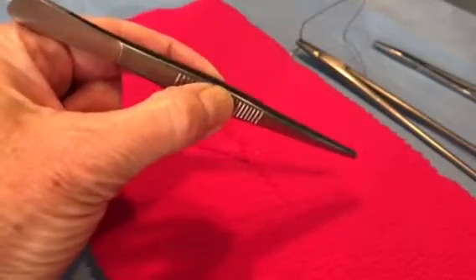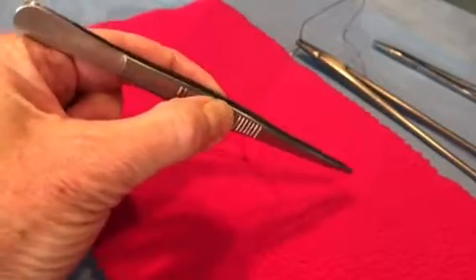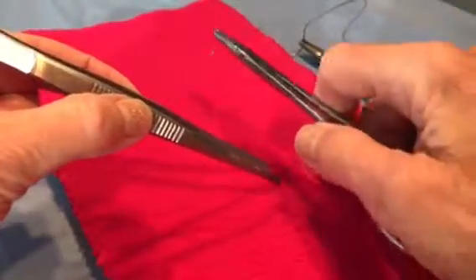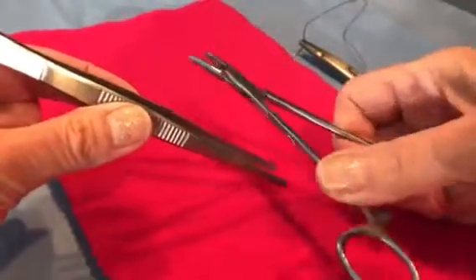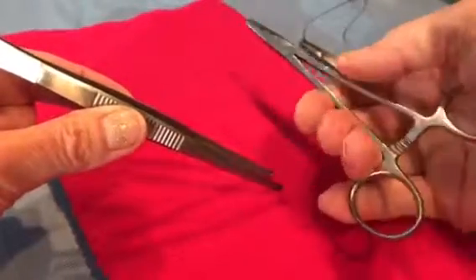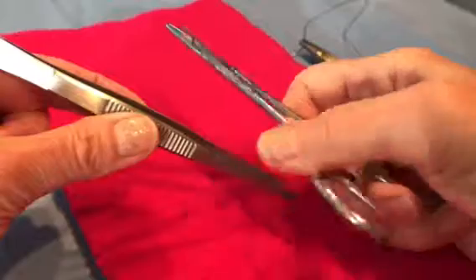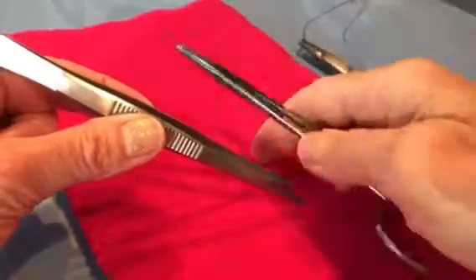These are typically used in your left hand if you're right-hand dominant. The needle holder is designed to be a right-handed instrument, so if you're left-handed, you may decide that you're going to use these in your right hand. They're certainly much easier to open in the right hand than in the left hand.